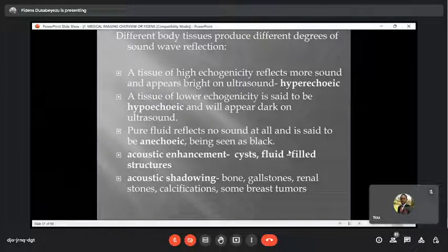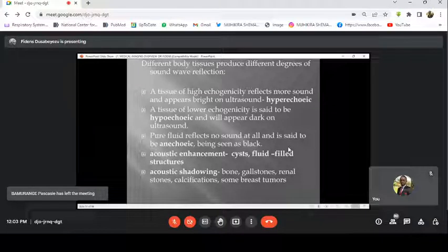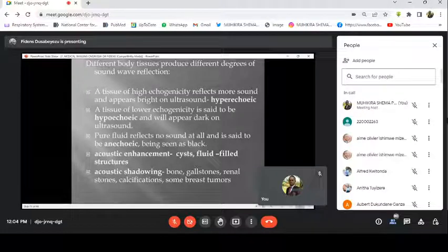It's clear. I was asking whether you may show us some more images consistent with acoustic enhancement and acoustic shadowing. Yes, let me see if I have them. That's very good. But you can get the idea at least. Yes. Okay. Can I go to another slide? Okay.